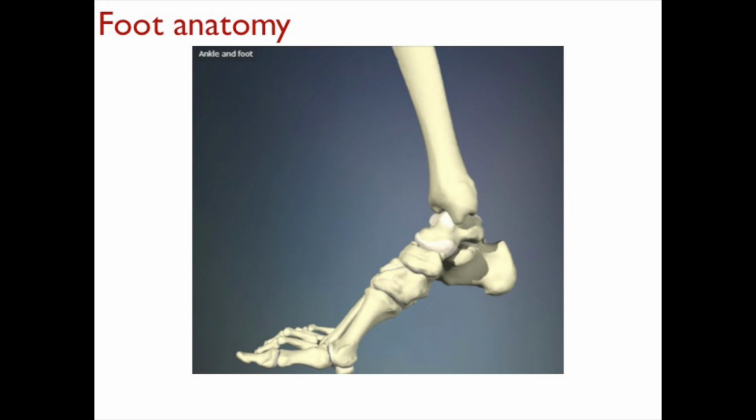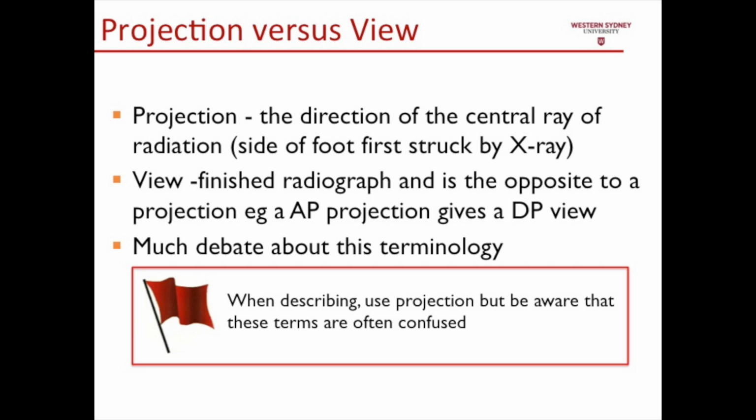So I would encourage in the practicals that you spend enough time looking at the architecture of the foot and considering how structures would be superimposed on each other with the differing projections and views. Now, when we are referring people for x-rays or looking at x-rays that have previously been taken, we will need to consider how the x-rays have been taken and what the x-ray will allow us to visualise in terms of the view that this gives.